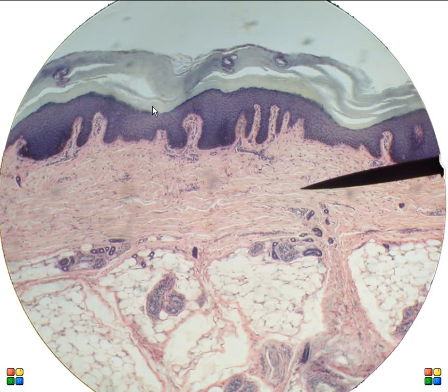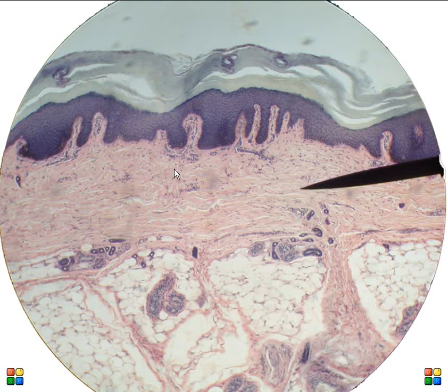Let's move away from the epidermis and go to the dermal layer of the skin. This is the dermis — again it's dense irregular connective tissue with lots and lots of collagen fibers, but also some elastic fibers to give it resiliency.